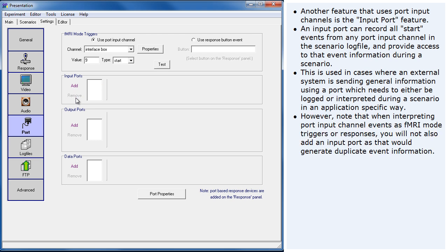However, note that when interpreting port input channel events as fMRI mode triggers or responses, you will not also add an input port as that would generate duplicate event information. In our example, we would not use an input port.